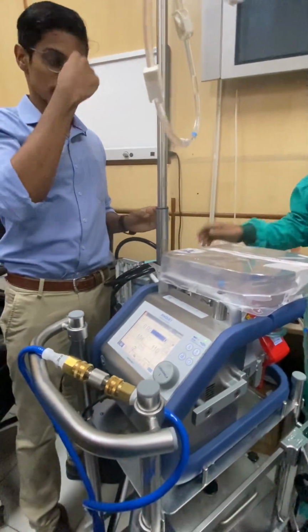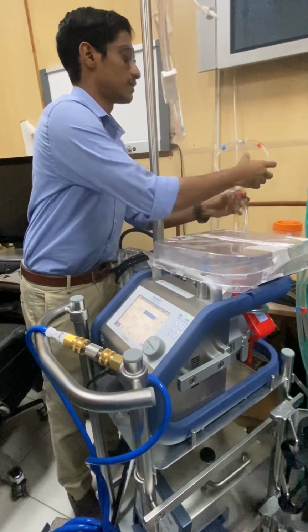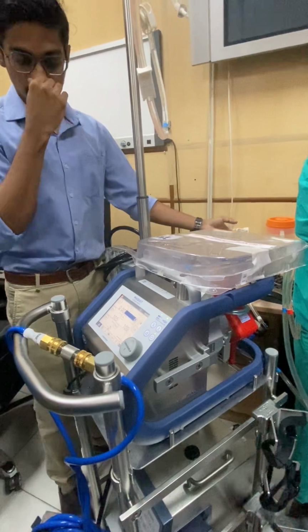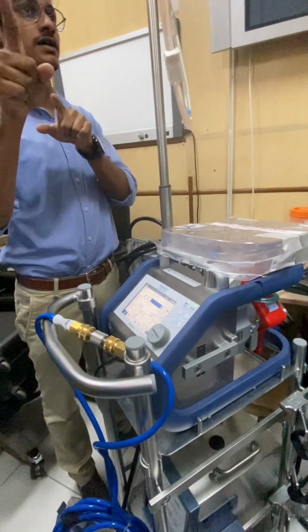Now the function of this bag is done. It's primed. Make sure you have clamped it because there will be some air here. Next, the machine side everything is done now. Now you want to connect it to the patient.